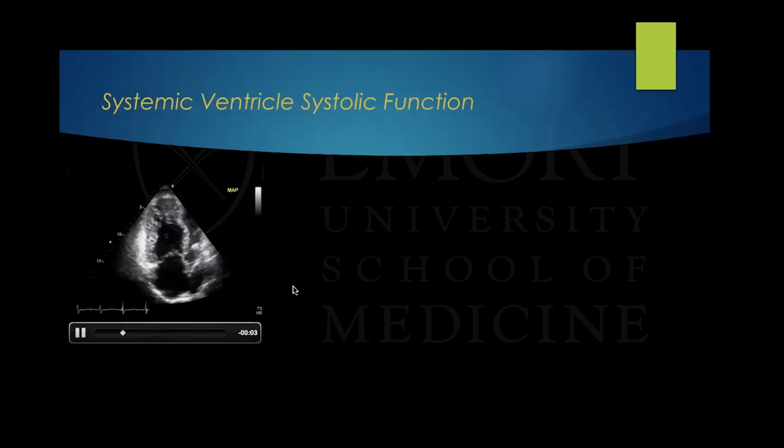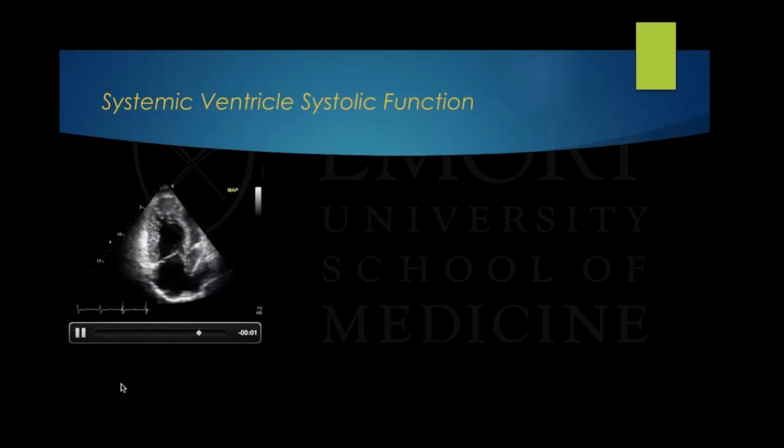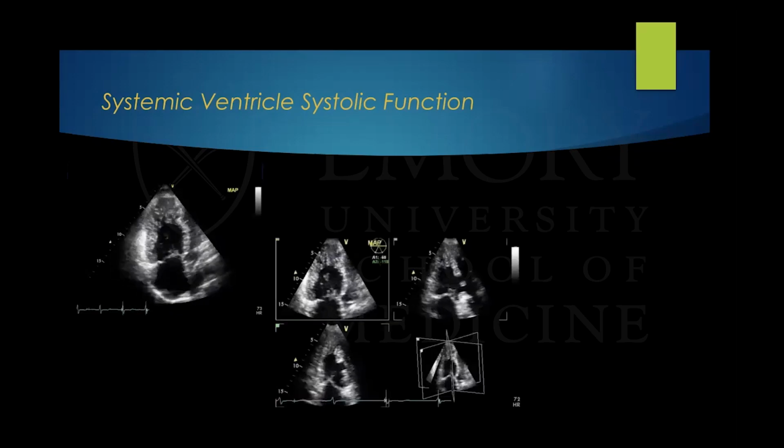So the other problem that we can encounter is dysfunction of the right ventricle. Over time, these ventricles get insufficient and the function decreases because it's a ventricle that was not made to pump blood to the high pressures towards the aorta. So we have to be carefully assessing this function every time the patient comes to clinic.